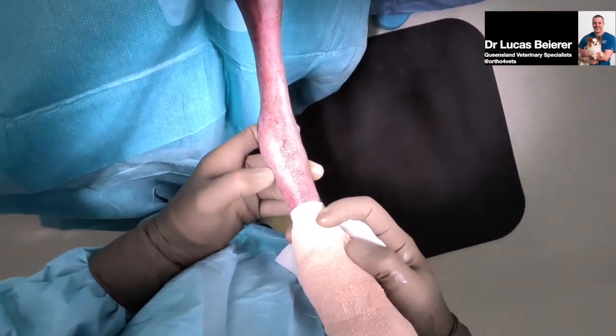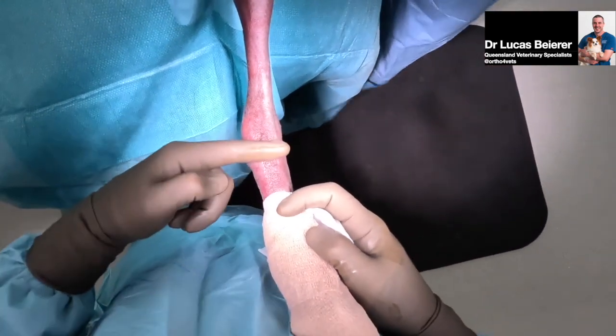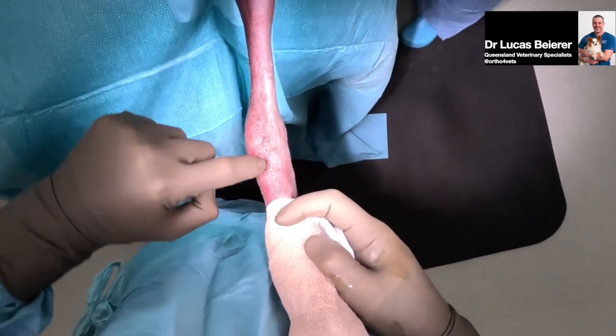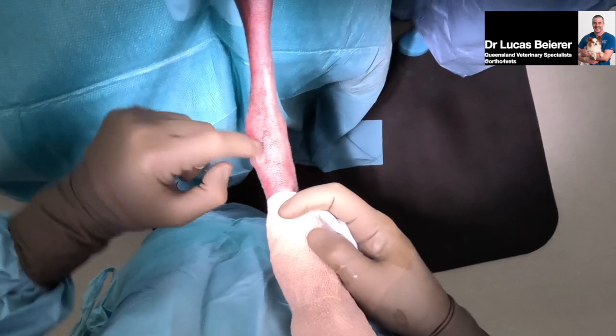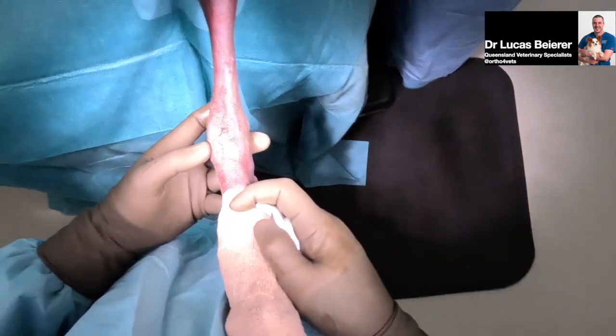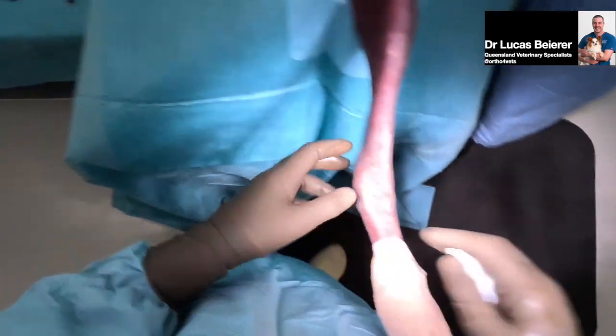So we can sort of feel the deficit there. We'll have a screw that goes this way, we may have a screw that goes that way. So that cranial screw ends up being about here. So we'll make our incision in this location with the awareness that there's going to be some real wound challenges in this breed.